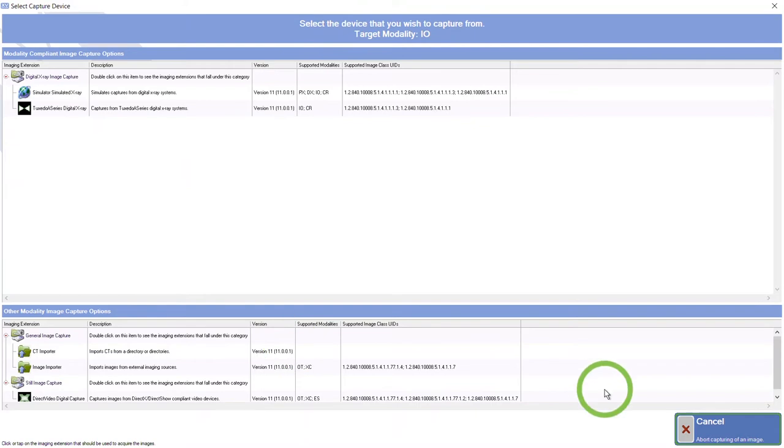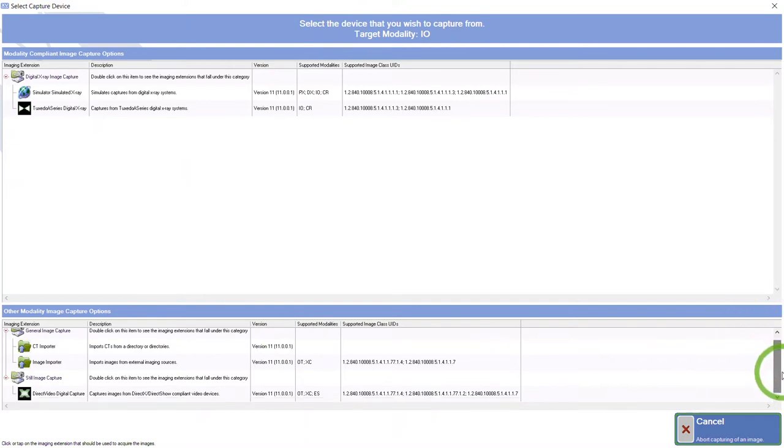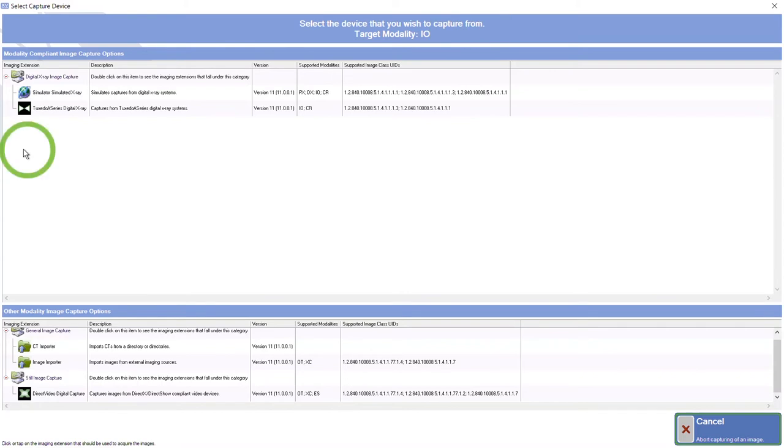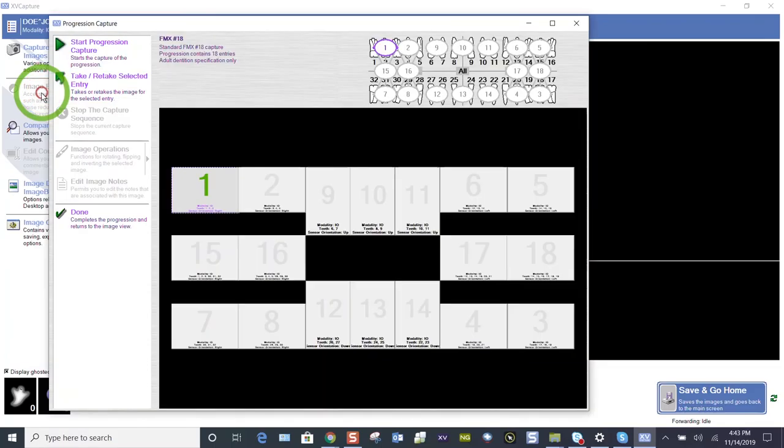The lower part of the screen, you can see if you're importing an FMX 18 or if you're wanting to use your digital, the direct video, which is your intraoral camera, you can do that too. So select the device. My device is a simulator, simulates x-rays. And we're here.